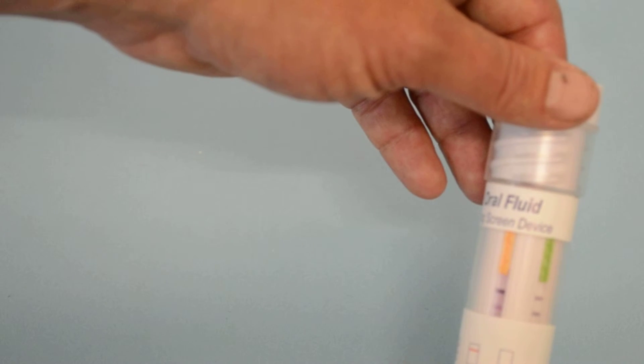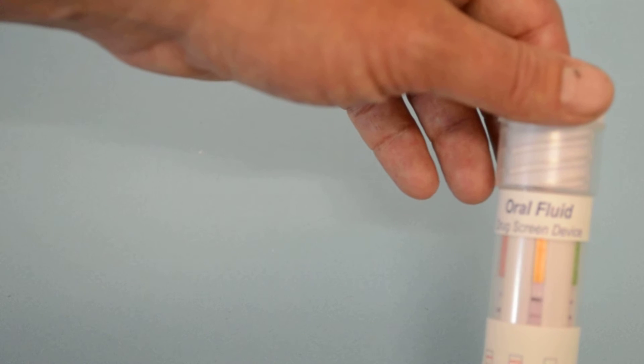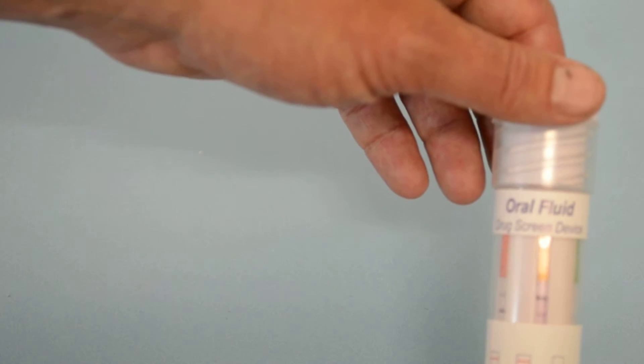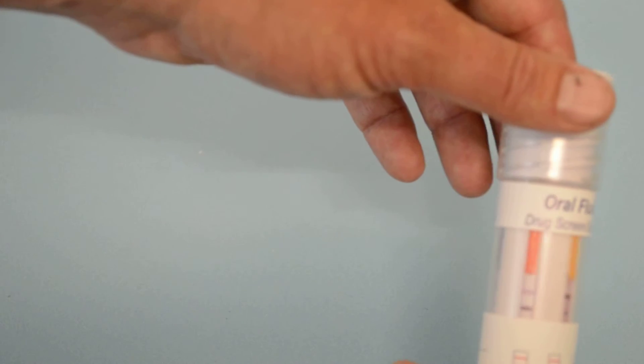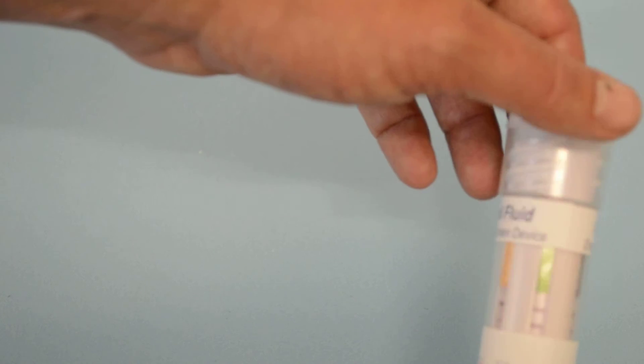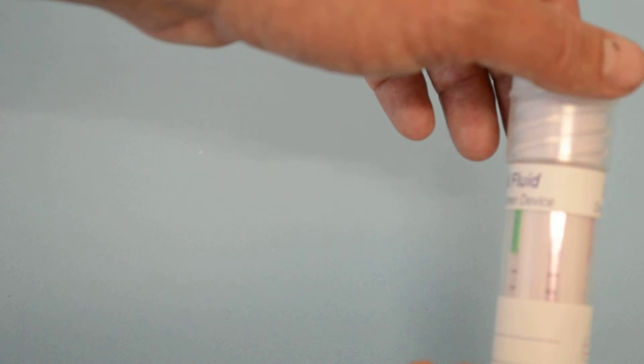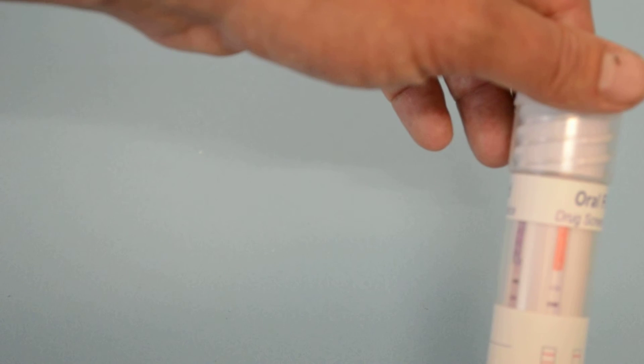An invalid test result as demonstrated on this sample here would be an absence of a control line. If there is no control line, even if there are test lines showing, you must not interpret that result. It's an invalid result and you must repeat the test with a further sample.